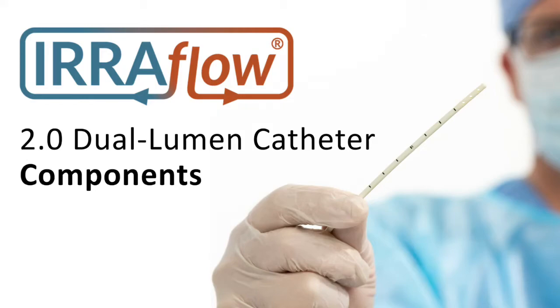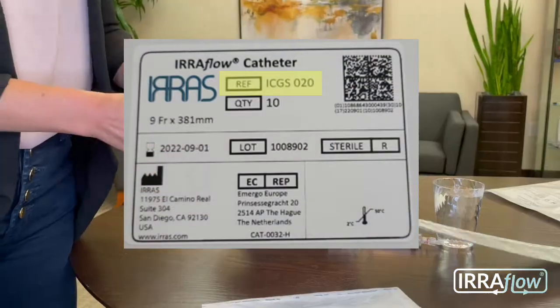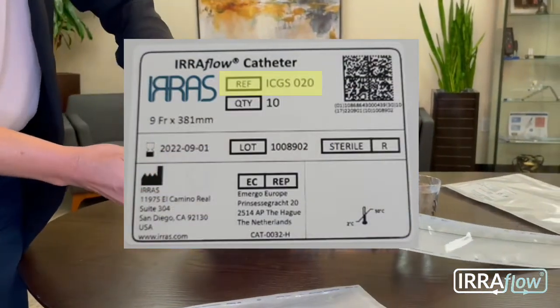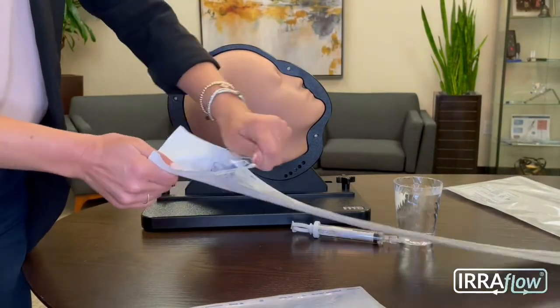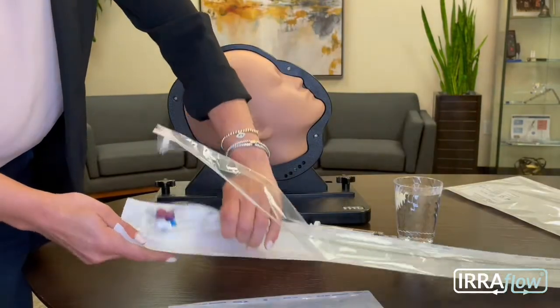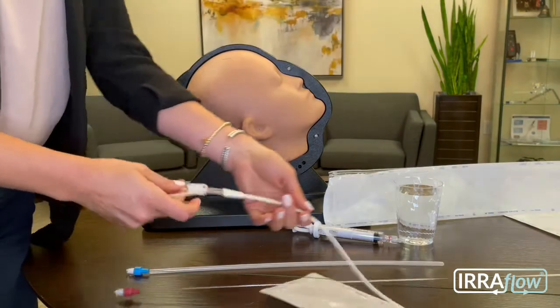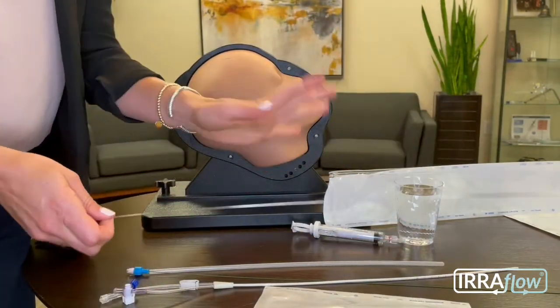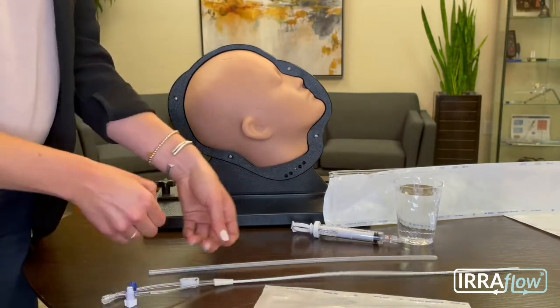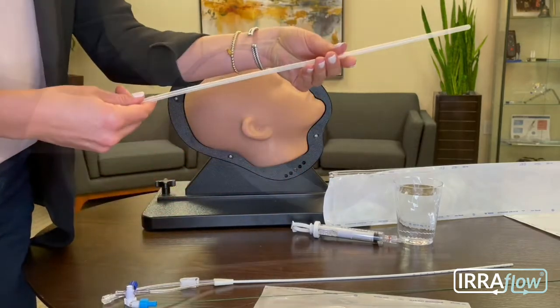Let's review the IRRAflow 2.0 dual lumen catheter. When looking at the packaging, you'll notice on the label it shows the catalog number as ICGS 020 with 2 sealed packages. When opening the catheter packaging, you'll find the IRRAflow 2.0 dual lumen catheter, a hard stylet, a soft stylet, and the tunneler.